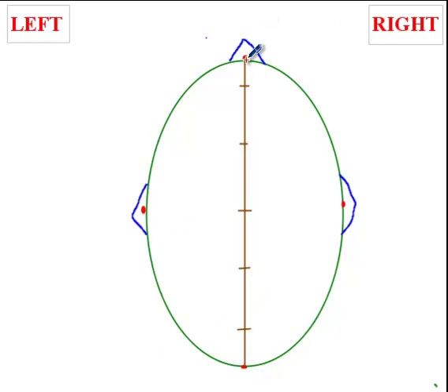When you measure 10% from the nasion, and put the mark here, this is a landmark called FPZ.